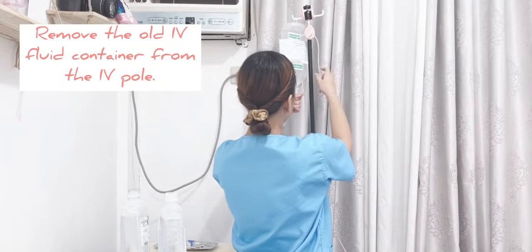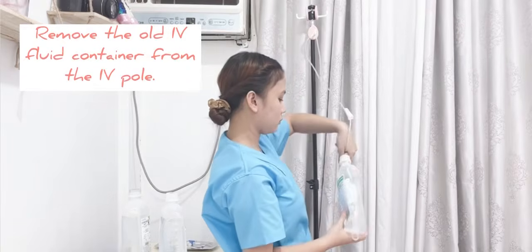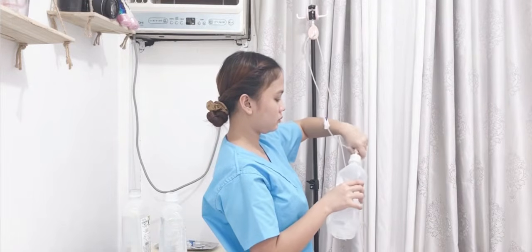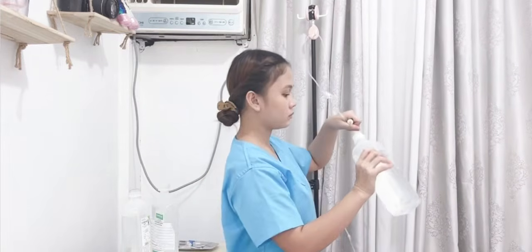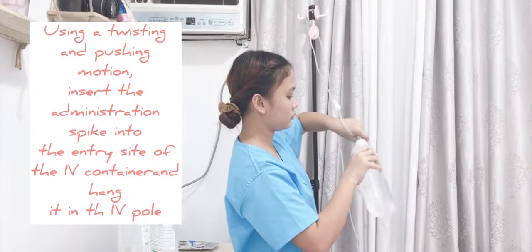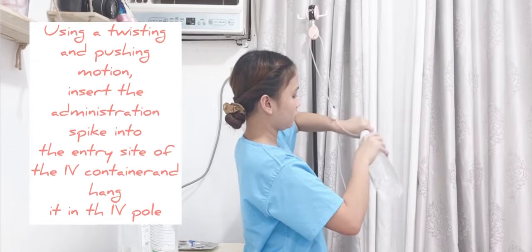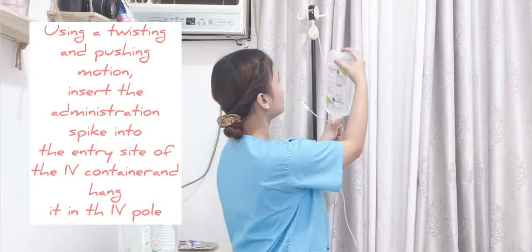Then kink under the drip chamber, then remove it from the IV stand upside down. Then, quickly remove the spike in a twisting motion and see to it that you are not going to touch the spike and make sure that you are only holding the drip chamber. Then, using a twisting and pushing motion, insert the administration set spike into the entry site of the IV container. Then, hang it in the IV stand and release the kink.